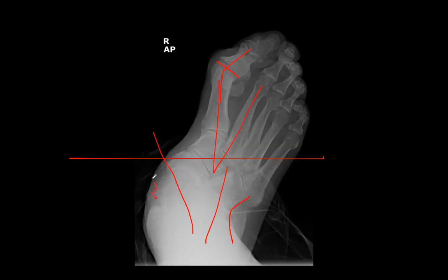Talar articulation. Good. So we see all of that. That's talar head uncovering. And the easiest way to look at talar head uncovering is to bisect the talus like we did here and to say, okay, that goes through about 50% of the talus. So we have about 50% uncovering here. Normal should be about 25%, 30%, but we have significant talar head uncovering there.